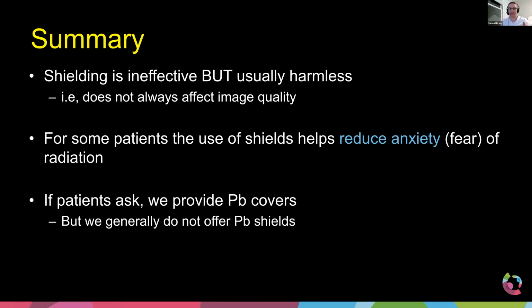So the amount of radiation that the system used was really low. In our case, it ended up being less than 10 milligray to the fetus. And 10 milligray is, when you look at the guidelines here in the US for imaging and exposing a fetus to radiation, anything less than 50 milligray is just negligible. It's just no risk.